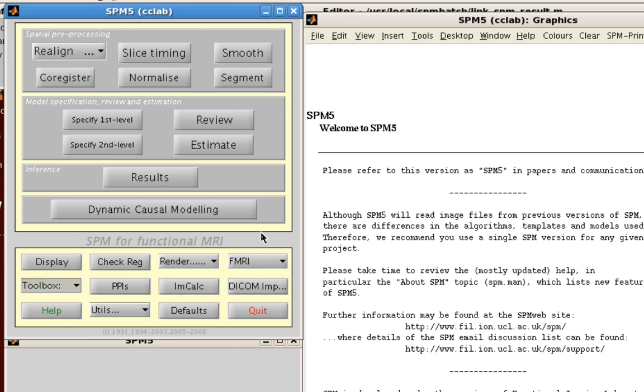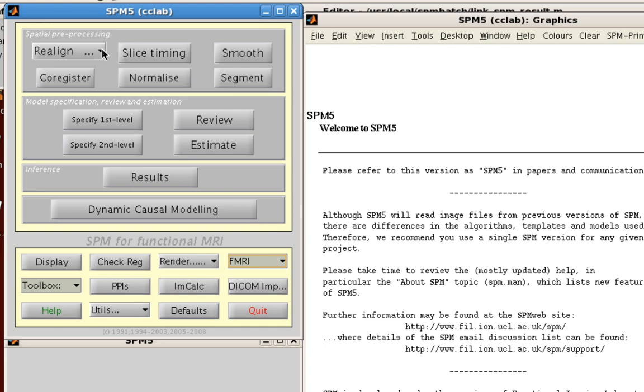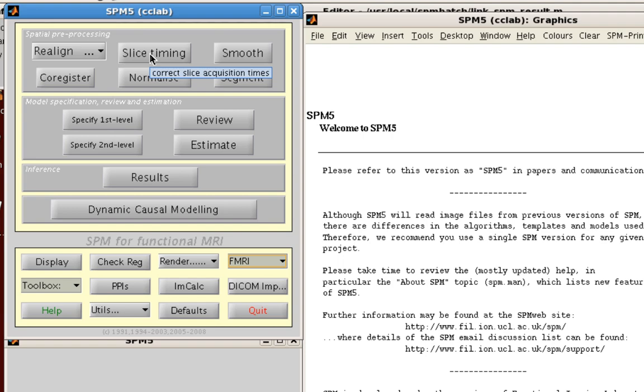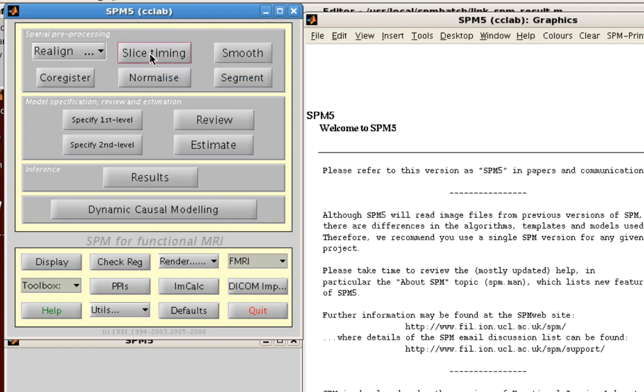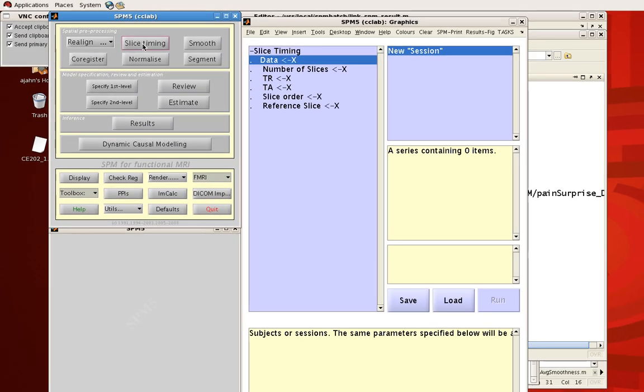Now if you have by some mistake opened up the fMRI version of SPM you can also change that and go to EEG or PET if you so desire. So that's how you start up SPM and I'm going to briefly cover what it looks like when you go into one of these buttons. Let's say slice timing for the sake of argument.